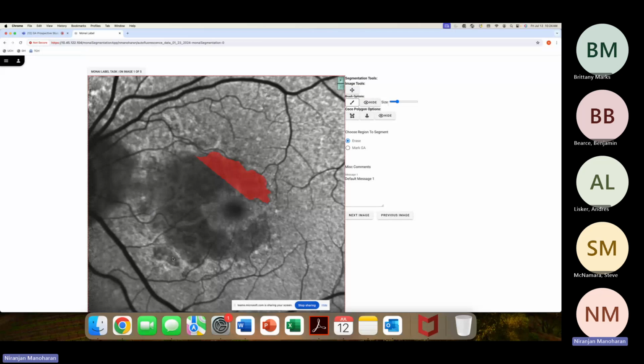The ones that are going to be hard to notice the difference, at least for me, were the peripheral lesions that could be iRORA, incomplete atrophy versus complete atrophy, like these more dense areas. I think if it's really dark, you could include them. If not, you could exclude them. Over time, we're going to have multimodal imaging with an OCT overlay, so you could tell if this is iRORA or cRORA. But for now, get the areas that you know for sure are GA.